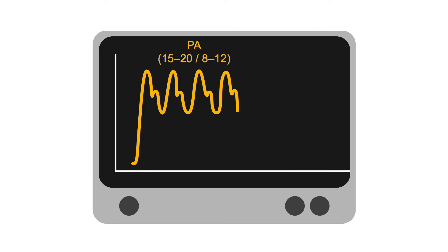Let's practice obtaining the very important wedge pressure. Watch as the balloon inflates and we see the PA waveform transform into a venous waveform. Notice the overall pressure is lower and the waveform is exactly as we expect for venous and is not over-damped or flattened.